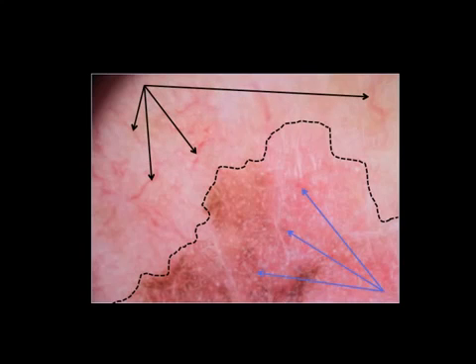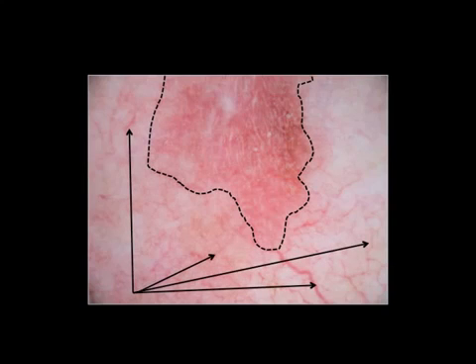If we look at this lesion and outline its border, we can see that the vessels are different outside and inside. Inside: milky red areas. Outside: arborizing vessels not sharply in focus, as you see on sun-exposed face. In this case also it's very different inside and outside the lesion — outside arborizing vessels not sharply in focus, inside milky red areas and densified vessels with enlarged calibre.